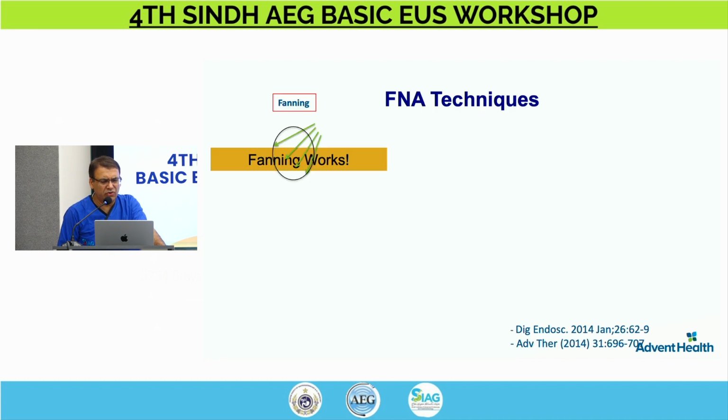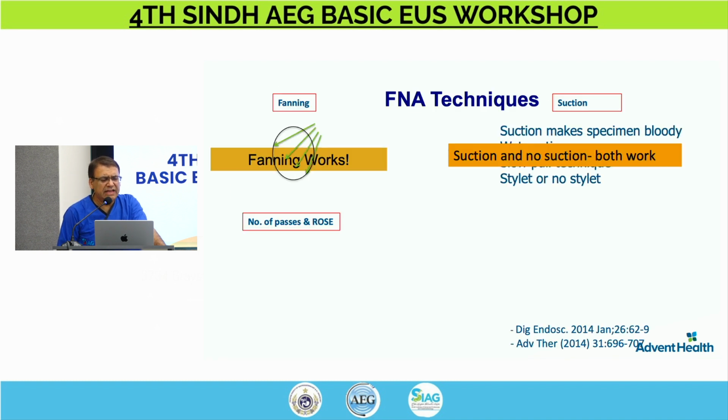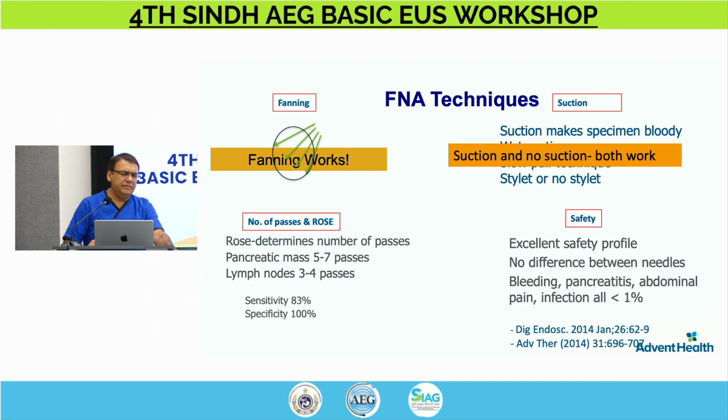So no need to go into details of FNA technique or FNB technique. One thing we all know about is the fanning. Fanning, I think I mentioned quite a bit yesterday too. You go into the lesion, and if it's a core needle, you just want to go in one area just once or maximum twice.